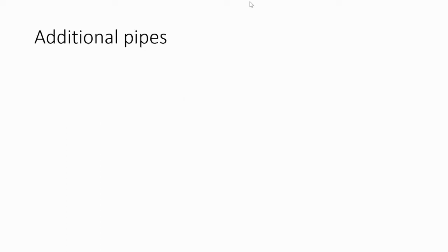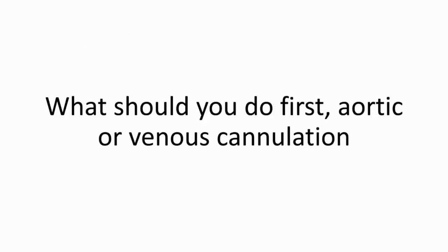So one thing I haven't included in the slides, which is of utmost importance, is putting the pipes in the patient is not the same as going on bypass. Okay, so does anyone know what medication we must administer to patients before we can safely institute cardiopulmonary bypass?